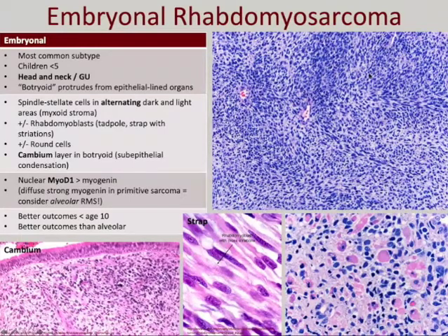Okay. Moving into the malignancies of skeletal muscle, embryonal rhabdo. So, characteristically, this light and dark mixed pattern. Remember that the botryoid variant of embryonal is just the protruding variant from an organ, like the mouth or the bladder, etc. You may see cross striations or just large eosinophilic rhabdoid cells. Remember, desmin and myogenin, myo-D1, for any of your tumors of skeletal muscle differentiation. Desmin, myogenin, myo-D1.